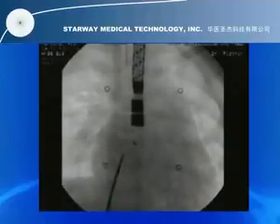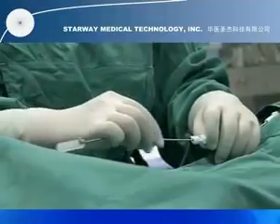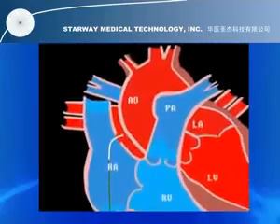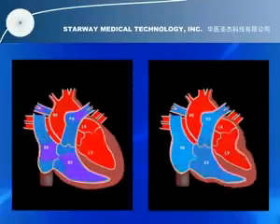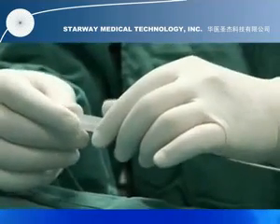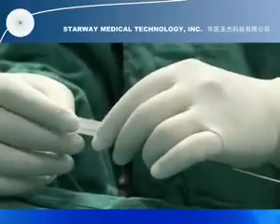With the observation of fluoroscopy and echocardiography, the delivery cable is pushed forward and pulled backward repeatedly with the proper tension to confirm a stable position of the device. If misplacement occurs, the occluder can be retrieved into the delivery sheath, redeployed, or replaced by another device. The device is released by unscrewing the delivery cable counterclockwise using the plastic vise as indicated by the arrow on the delivery cable.